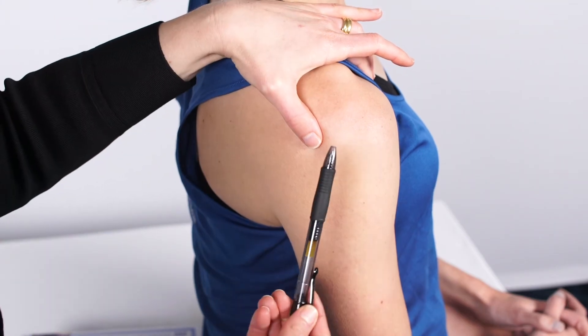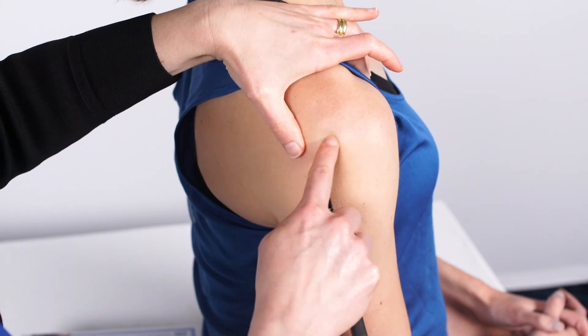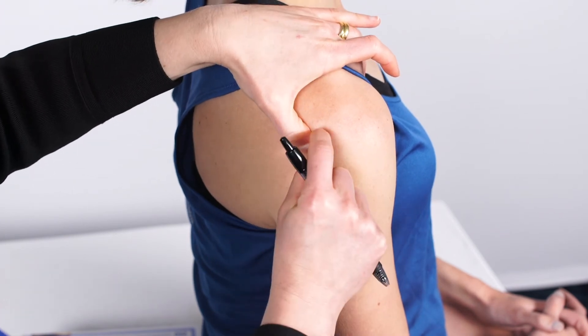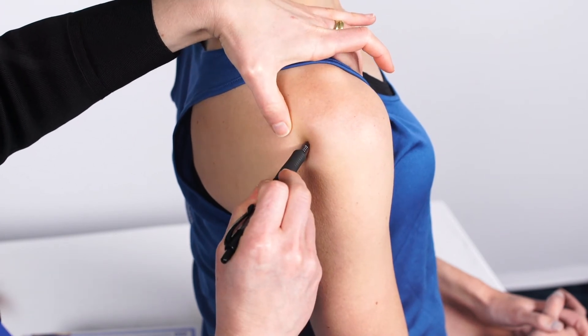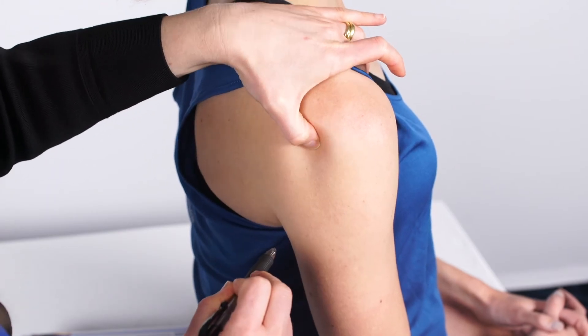Using the blunt end of a pen I like to mark the spot. Finding the bony edge of the posterior lateral acromion and going about a centimeter below, you'll find a soft spot just in the posterior aspect, and that's where I mark.